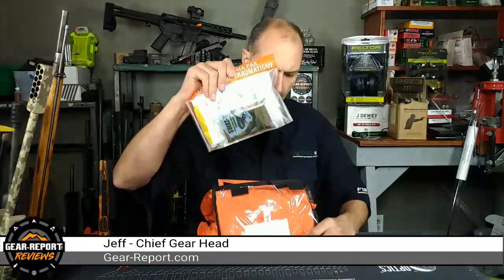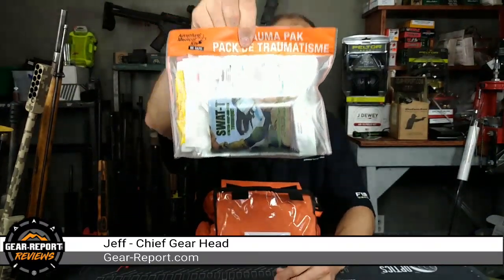All right, so let's come down here to the field trauma pack. And you see this has a different closure on it. Instead of a zipper, you don't have to worry about fine motor control working a zipper. Just rip it open, right? And it's removable. This is important because if you need to grab and go, you can take this out, toss it to one person, and someone else treats other people out of the other items.